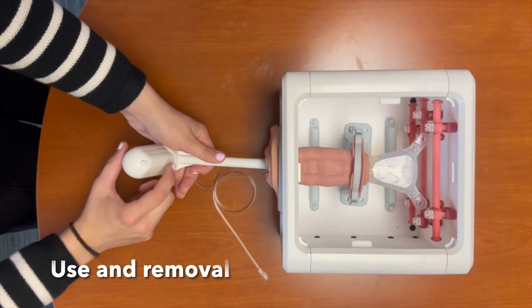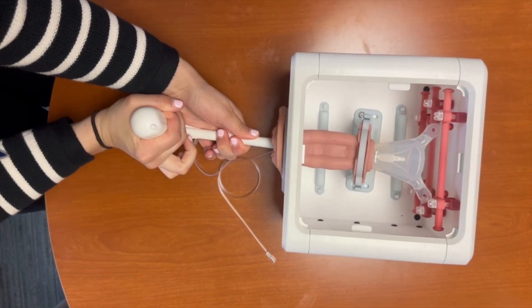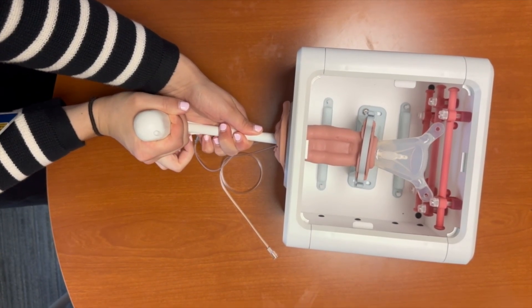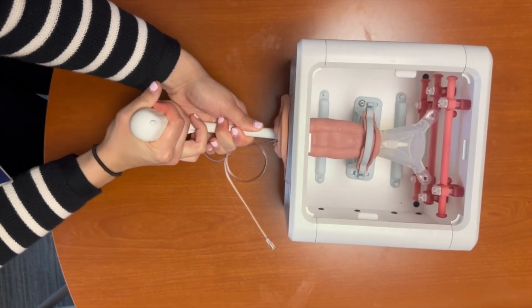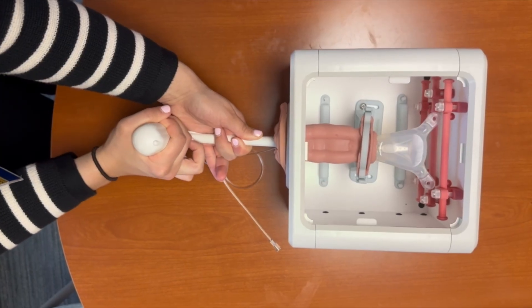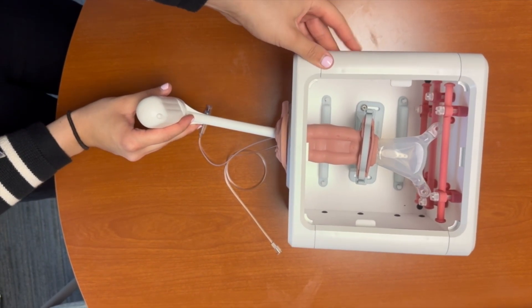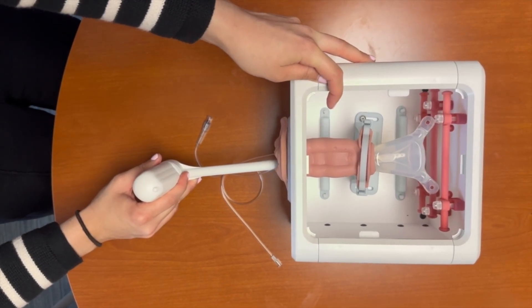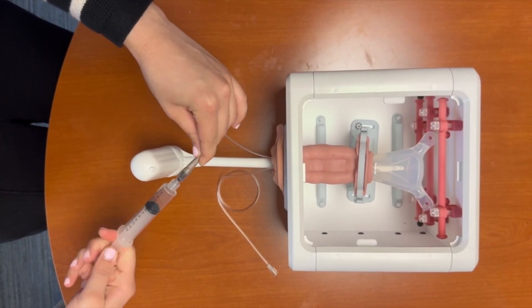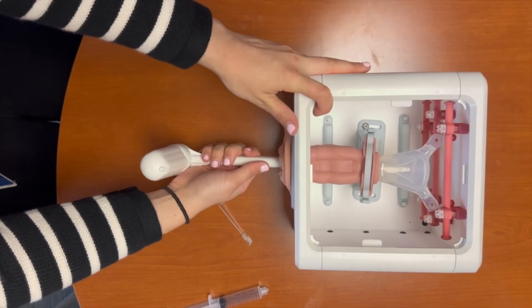To use the Clearview for manipulation, we rotate the handle. Rotating the handle to the right antiverts the uterus, while rotating to the left retroverts the uterus. Moving the entire handle to the operator's left moves the uterus to the patient's left, and moving the entire handle to the operator's right moves the uterus to the patient's right. To remove the device, we deflate the uterine balloon using the blue tip and then withdraw the device.